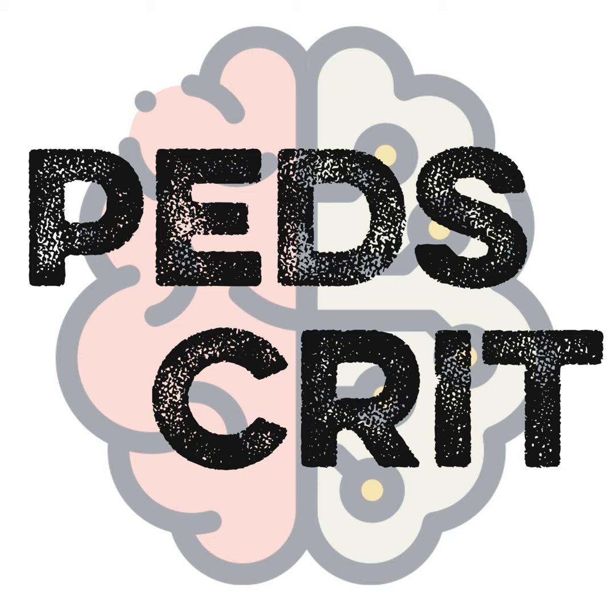Zach, I think when we started as fellows, we were in our first ECMO runs with these neonates and teenagers, we were scared a little bit and we were told to follow this protocol, and there's all of these steps to follow, but really getting that comfort. The first question I always ask before I make a change is to the ECMO specialist: how does your circuit look? How comfortable are you with the clots that are building up? Are they progressing? Are they better? And just knowing that it's okay to deviate away from that protocol a little bit if you're using good clinical judgment.